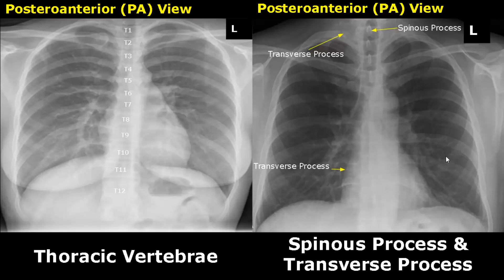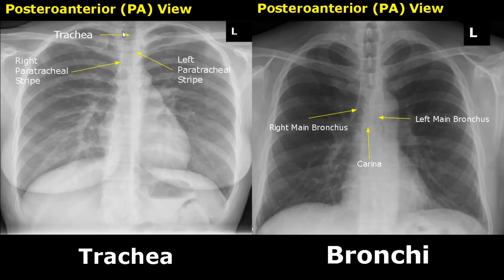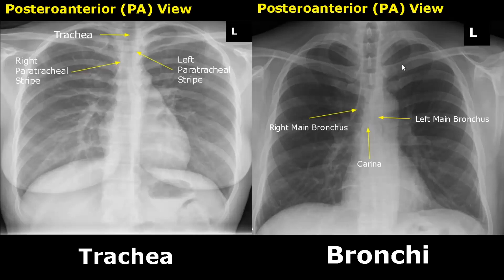The trachea appears as a radiolucent or dark tube-shaped structure because it contains air. It has bright walls which can be very well distinguished. The right tracheal wall is called the right paratracheal stripe and the left tracheal wall is the left paratracheal stripe. Both these stripes are radiopaque.